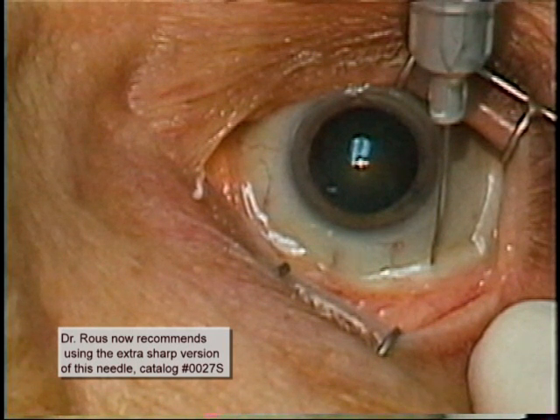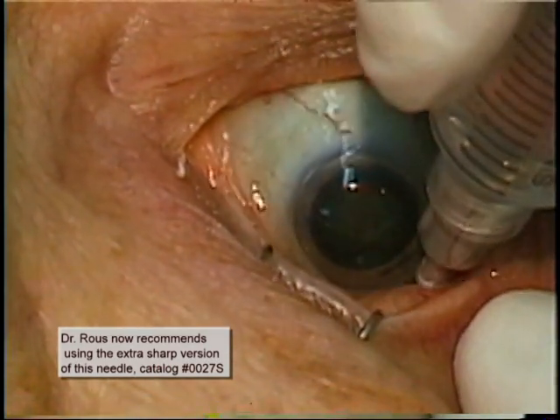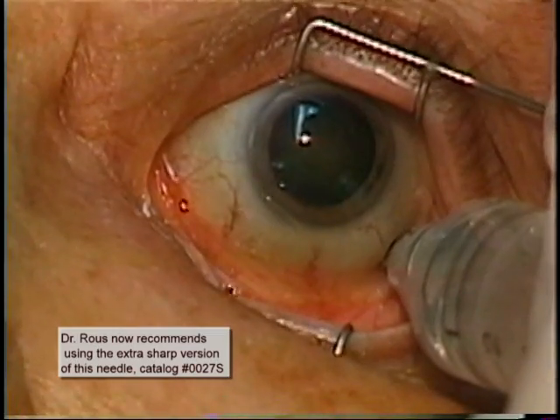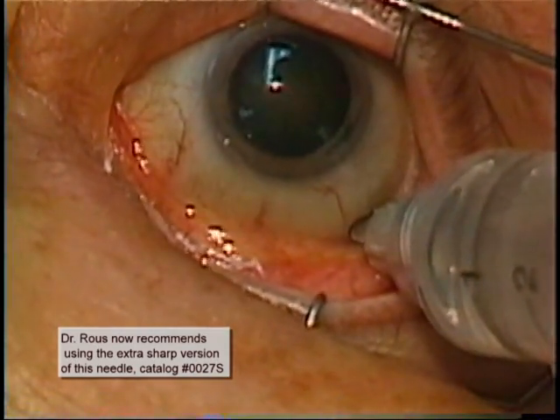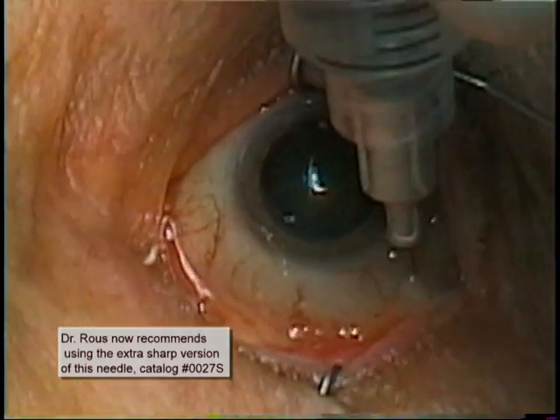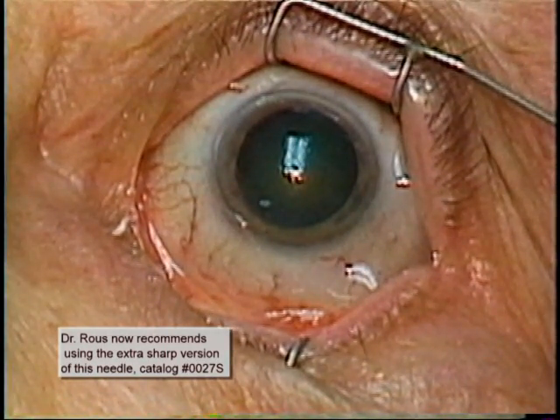In this fourth case, which is another left eye, the needle is positioned, as always, inferotemporally about 10 millimeters from the limbus, just before the bulbar conjunctiva reaches the fornix. Mild parabulbar spread is seen inferotemporally, superotemporally, and inferiorly as the anesthetic is injected. This will be easily dissipated, as shown previously, with the Honan's balloon and digital massage.